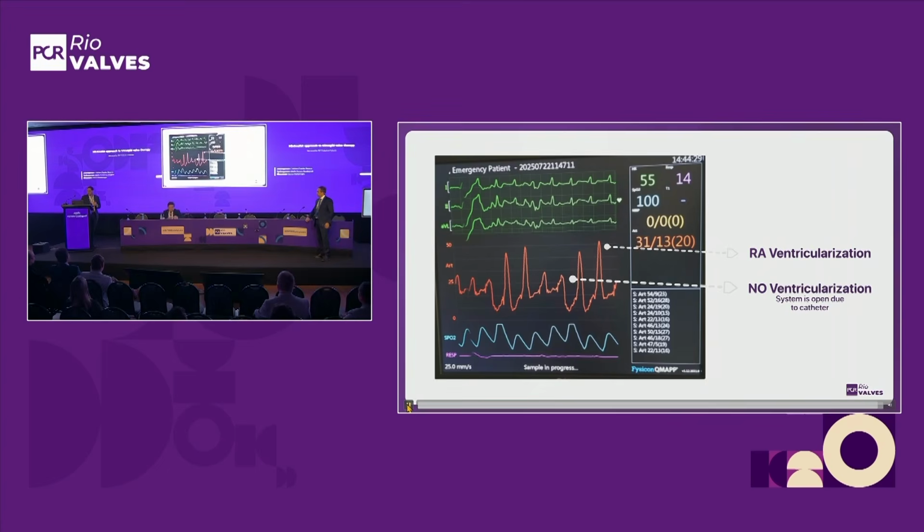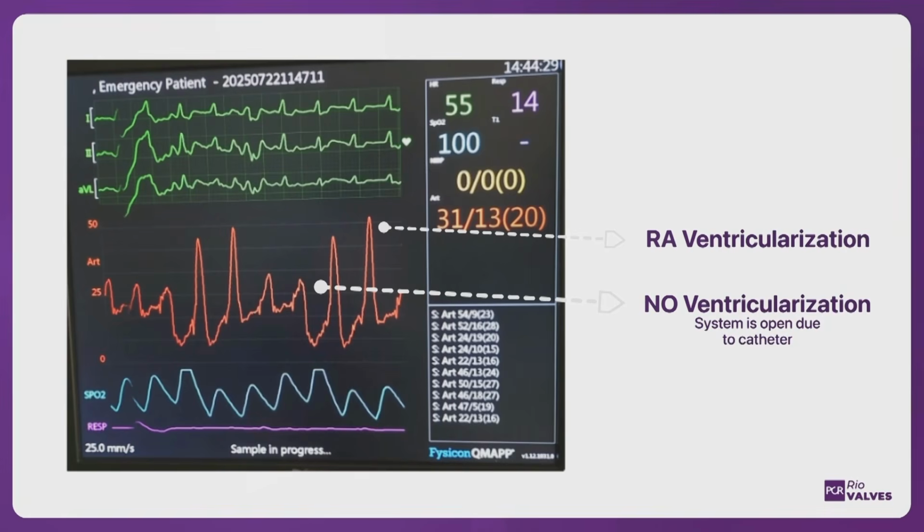The system working properly, how it decreases. So it is important to understand how the system works, and this is a very clear hemodynamic that shows how it works. Thanks again. So perfect, Adolfo. I think it's something you have to consider.